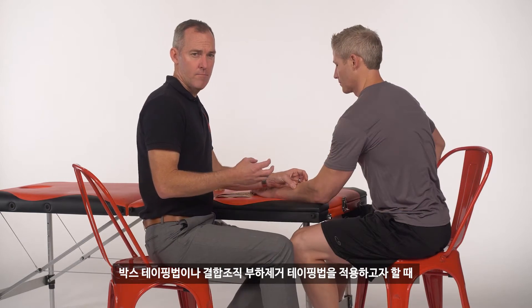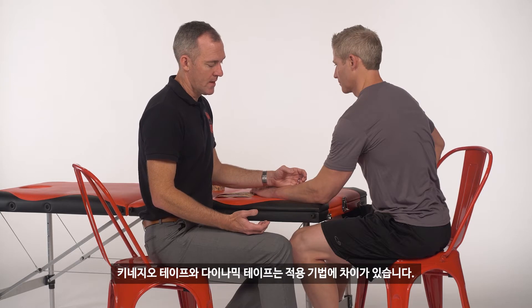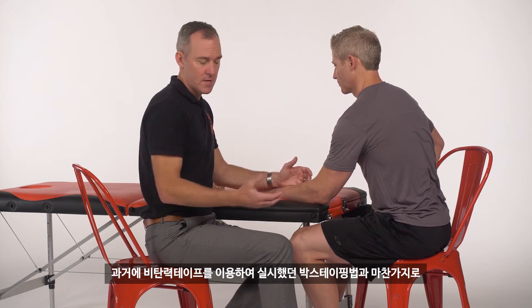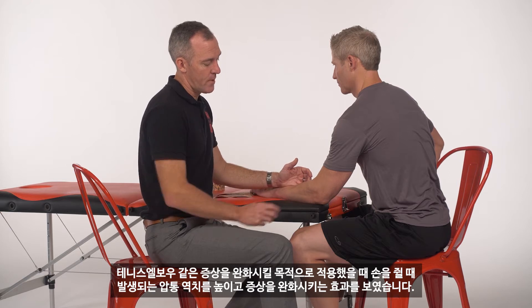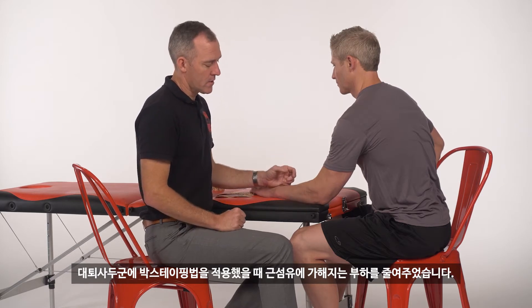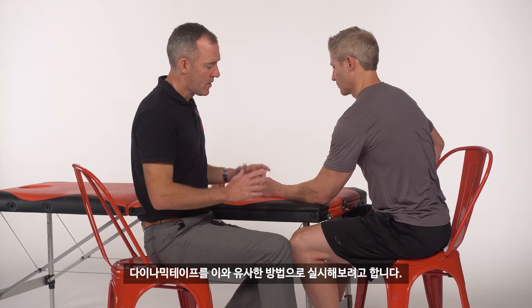There's quite a difference between the box or soft tissue offload that we do with dynamic tape and the space creation type of techniques with kinesiology tape, particularly with regard to the handling. Some of the box techniques using rigid athletic tapes have been shown to increase our pressure pain threshold, increase grip strength, and make improvements with things like tennis elbow. More recently, in 2014 Francois Hug and colleagues showed on the quadriceps muscle that we get a reduction in the stress on the muscle fibers when we box it all up using the resistance of the tape. We follow a similar methodology with dynamic tape.